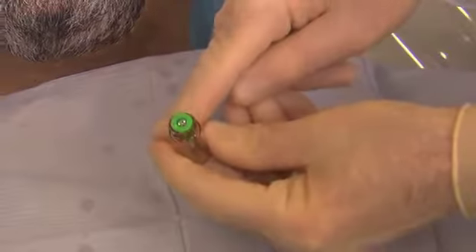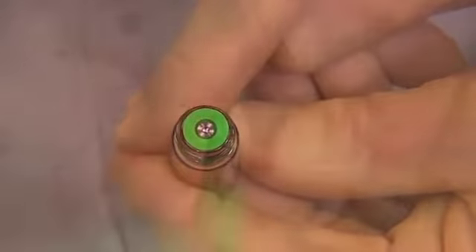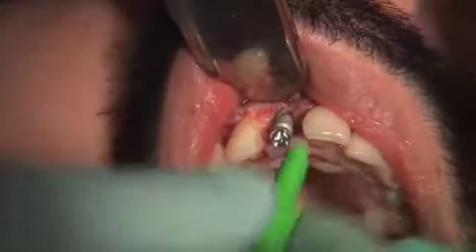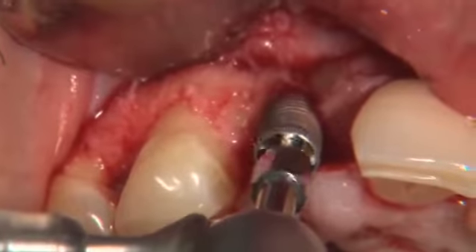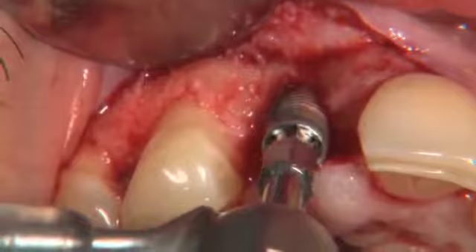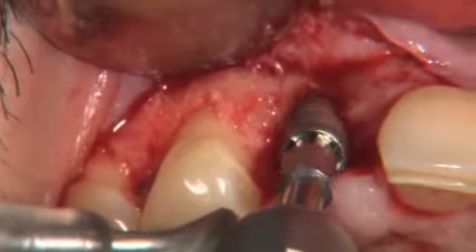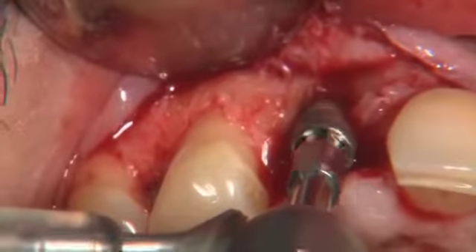As you can see, the cover screw is enclosed, inclusive in the event that we decide to bury the implant and utilize a cover screw. The implant is then hand delivered utilizing the serrated carrier, hand torqued in until it shears off. Next step is delivery with the handpiece hex driver. This is allowed to rotate until the osteotomy is fully engaged and the driver disengages itself, as you can see there.